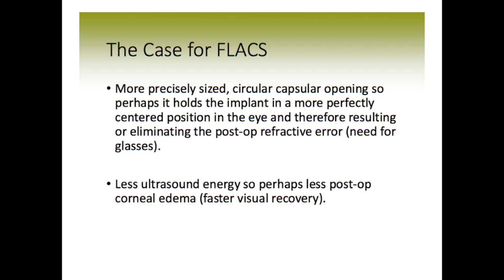So let's look at the case for FLACS. The idea put forward by the manufacturers and their consultants is that the laser creates a more precisely sized and circular capsular opening, so perhaps it holds the implant in a more perfectly centered position in the eye and therefore results in less of a postoperative refractive error, such as nearsightedness, farsightedness, and astigmatism.